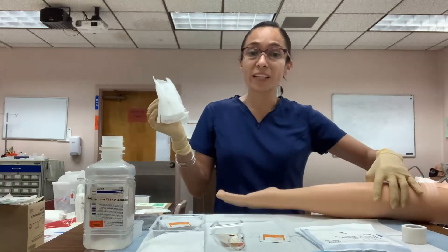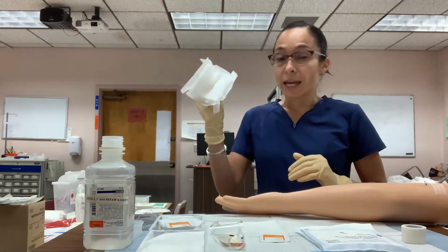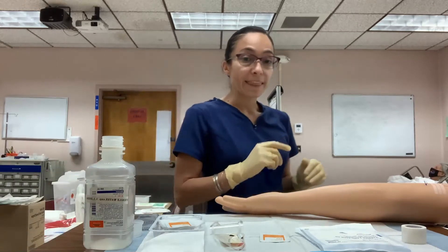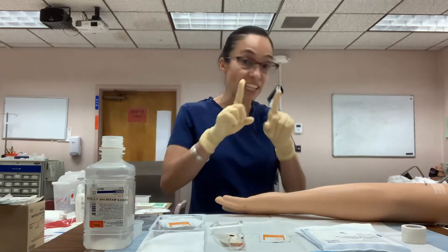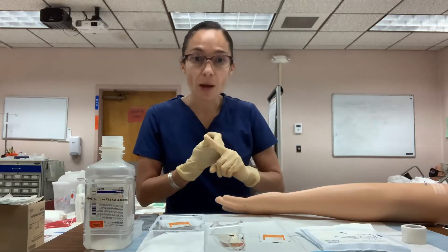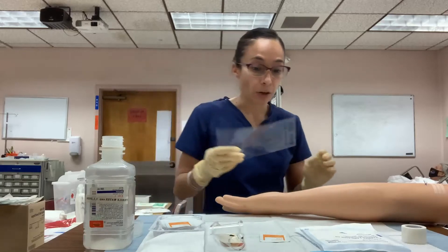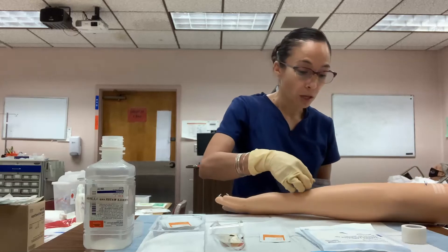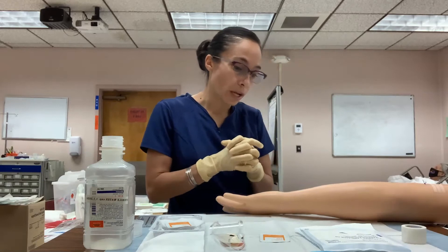After removing the dressing, assess it — note any drainage, its odor, amount, and color, then discard the dressing. Next, assess the incision area: count how many staples are present, check whether the edges are well approximated, and look for swelling, redness, erythema, drainage, odor, and the temperature of the surrounding skin. Use your measuring tape to measure the wound without touching it — for example, four centimeters long by half a centimeter wide.